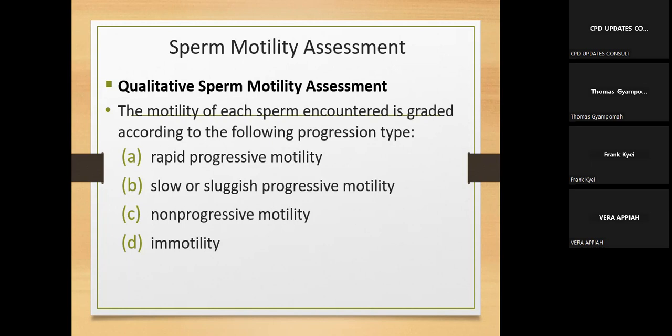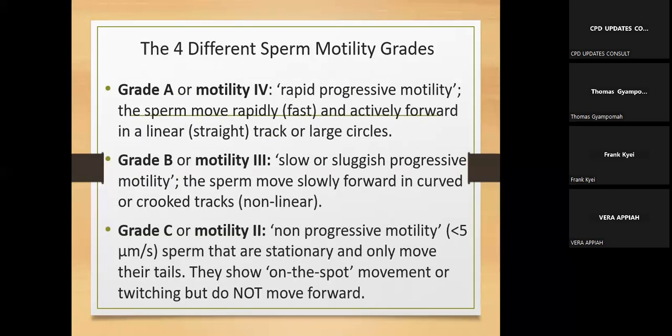So that's just by the way. So the non-progressive motility is moving, but it will not move an inch. It will just be standing one side, one point, on the spot, and shaking the tail. And he, according to him, is still moving. All right, that's just by the way.